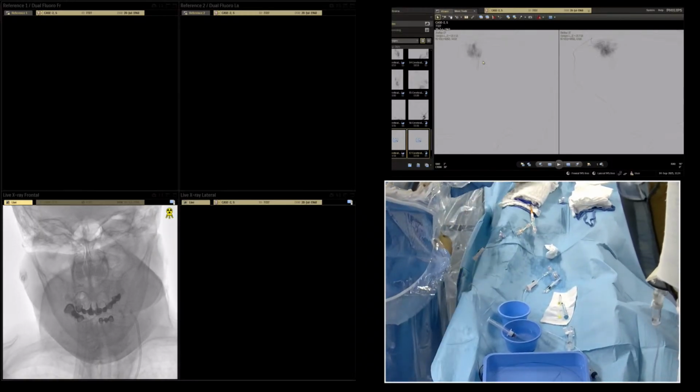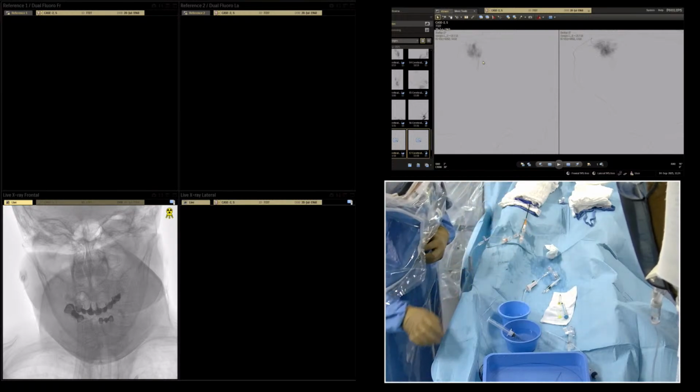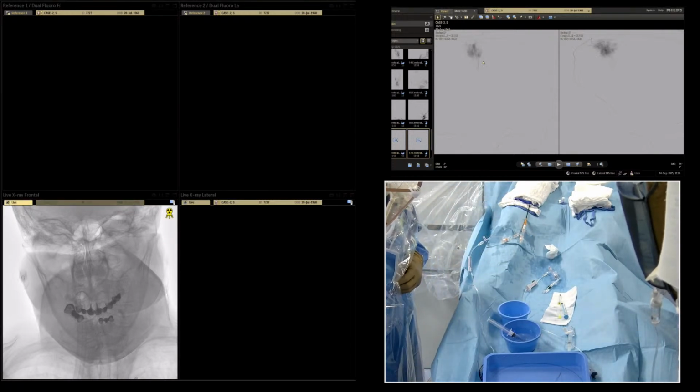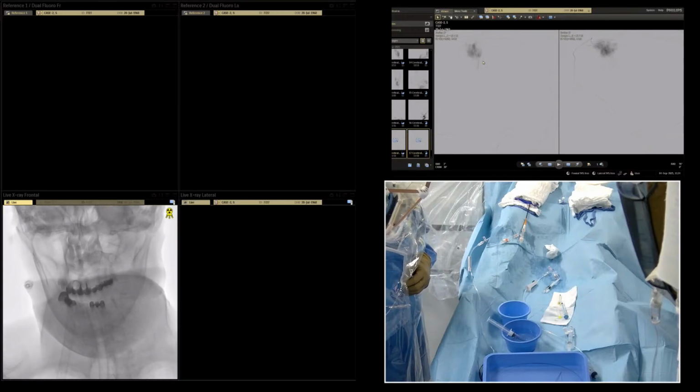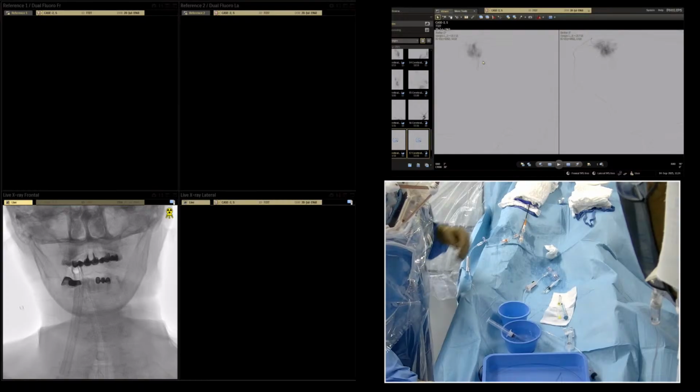Yes, we have a 5mm Derivo stent. I think it's one of the options, and Derivo could be started from 4mm as option number 1.